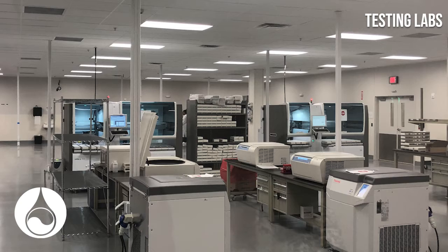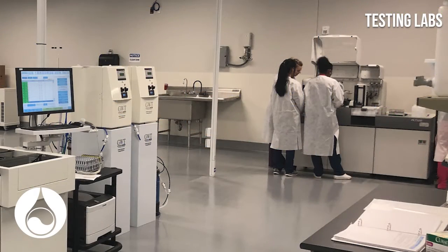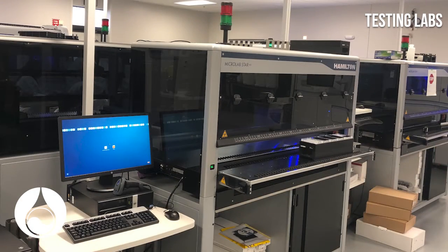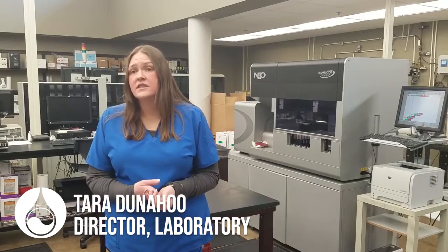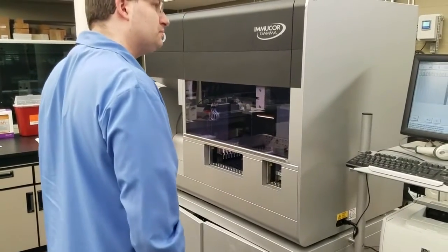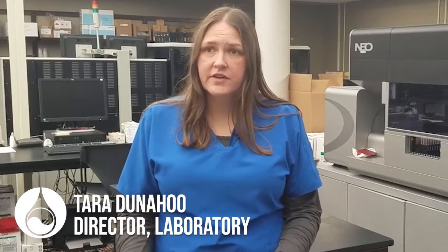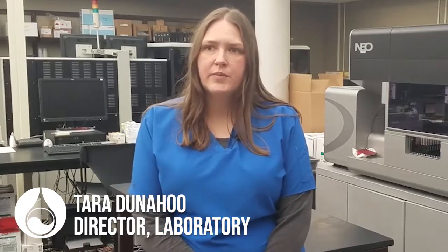The Blood Center's infectious disease testing is done off-site in a laboratory we've opened along with other independent community blood centers from around the country. The National Blood Testing Collaborative tests blood samples that are shipped each day from our blood drives and donor centers. So they're testing about 600 to 800 donors a day. The majority of the samples come in between 4 p.m. and 4 a.m. and their samples are processed and tested on the instruments for the various viral markers. And then first shift will come in and do the testing that hasn't been completed and then review the paperwork.